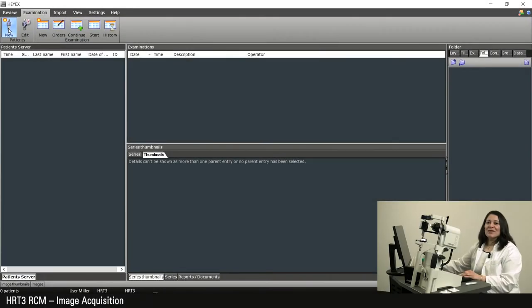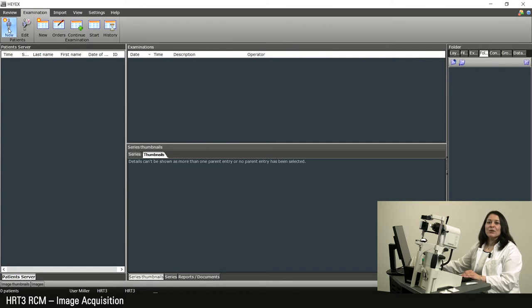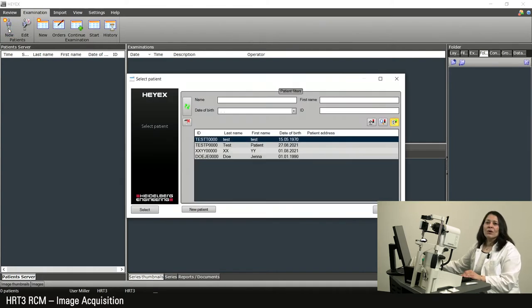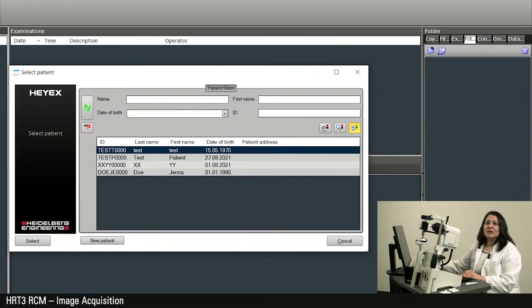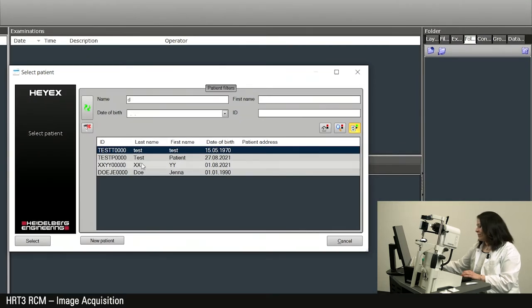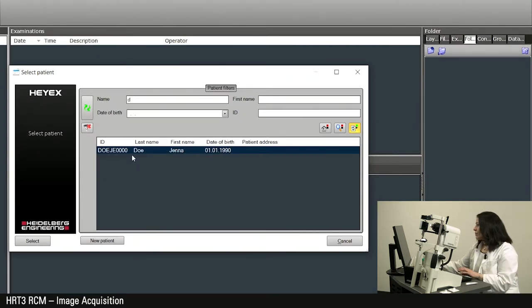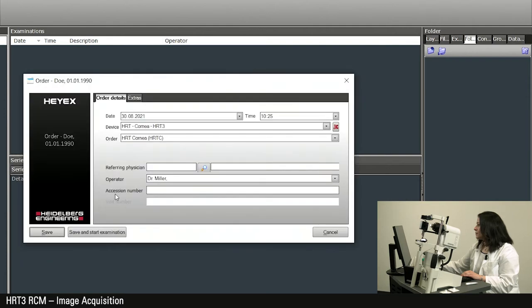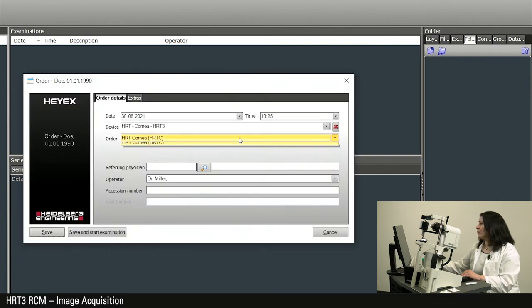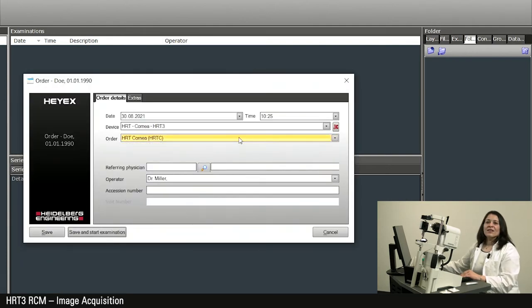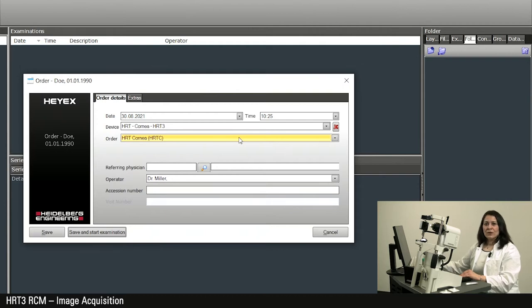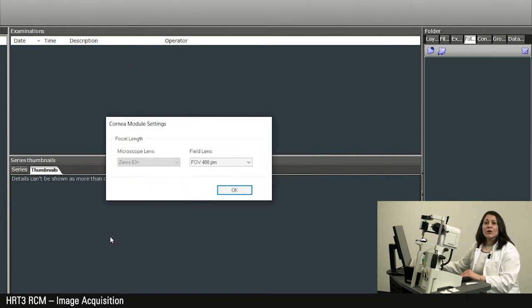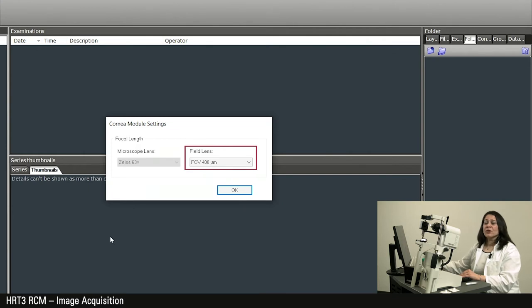Now we will start a measurement. Under the examination section, we will click on new patient and then create a new patient entry or search for an existing patient. I select HRT cornea as the examination order. The orders can be configured individually in the master data. Note that in the cornea module settings, the field lens is entered which is attached to the objective lens.